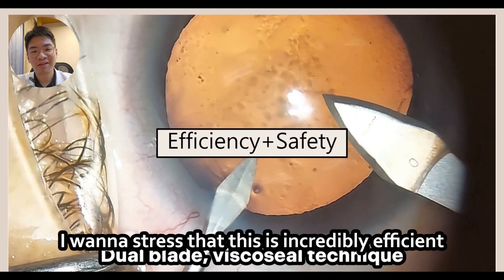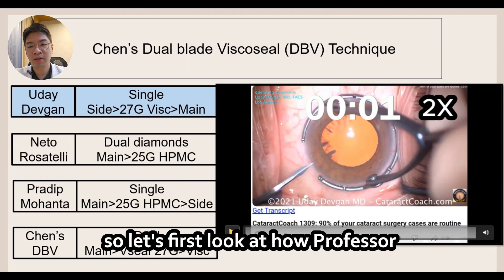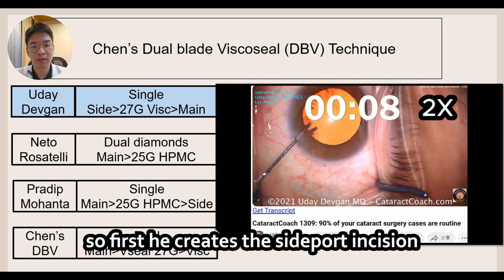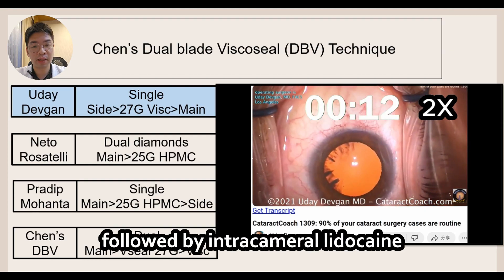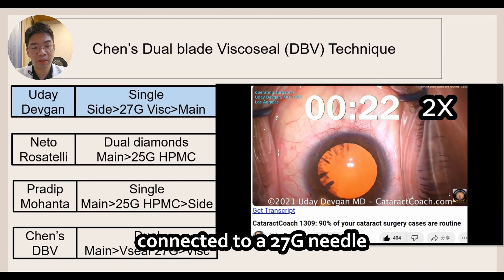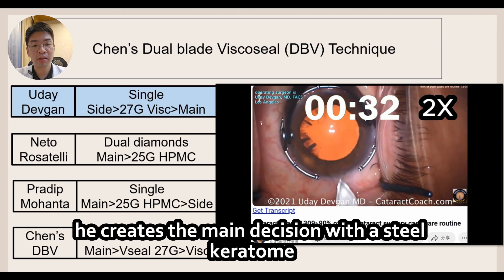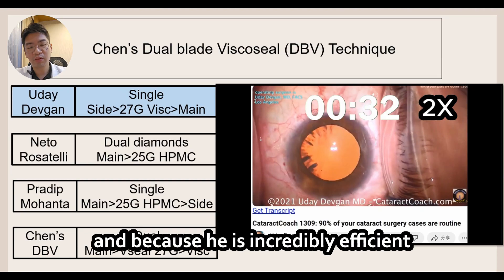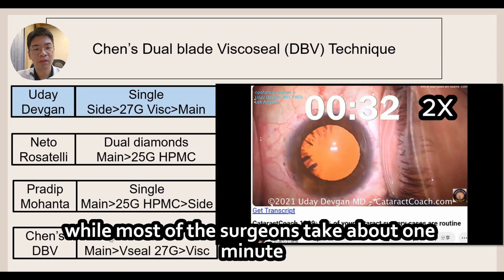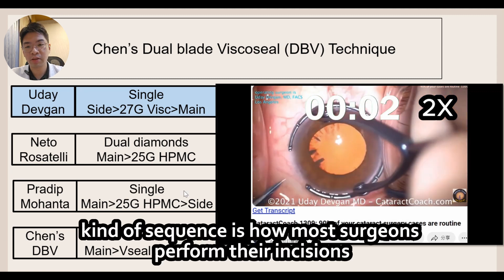I want to stress that this is an incredibly efficient and safe method. Let's first look at how Professor Uday Defkin performs his cataract incisions. He creates the side port incision followed by intracameral lidocaine, then injects viscoat connected to a 27 gauge needle, and then creates the main incision with a steel keratome. Because he is incredibly efficient, it only took about 32 seconds, while most surgeons take about one minute. This kind of sequence is how most surgeons perform their incisions.